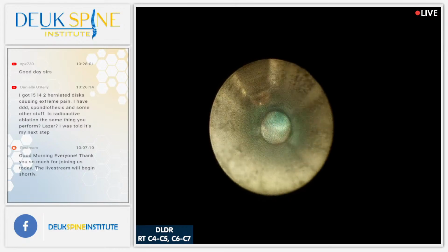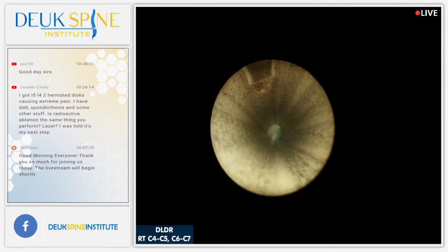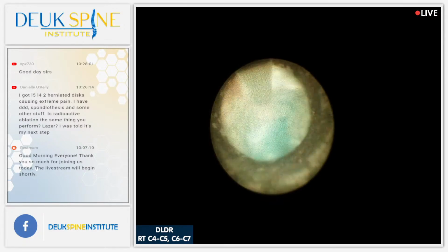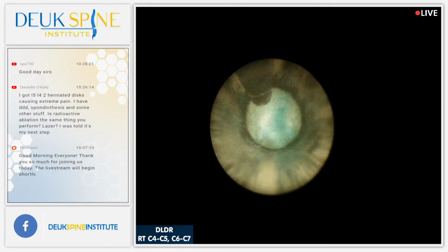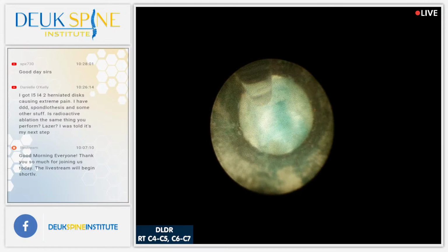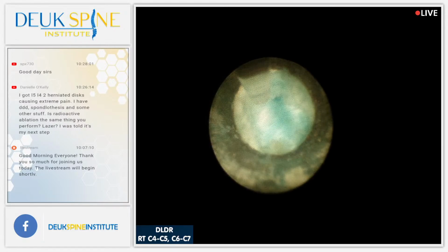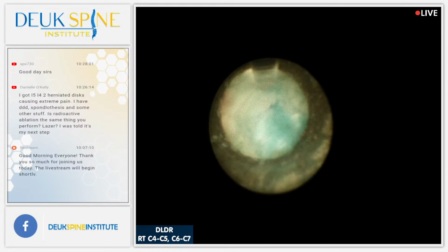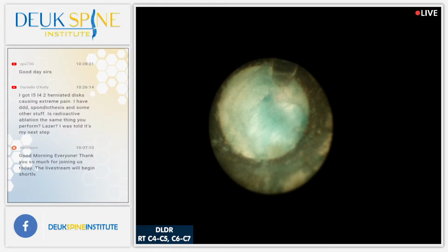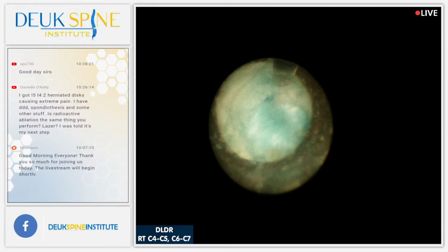This is definitely one I want to keep for educating. Please go ahead and get a couple of pictures, Henry, right here. Hold on. Let me just see if I can clean it up a little for you. Yeah, that's probably going to be as good as it gets right there. Go ahead and get a picture of that. Tell me when you're done so I can move on.